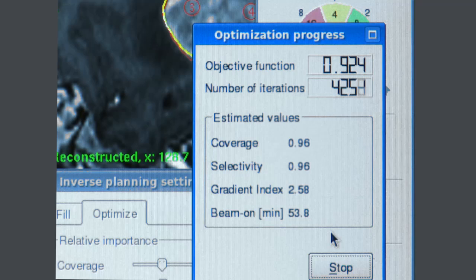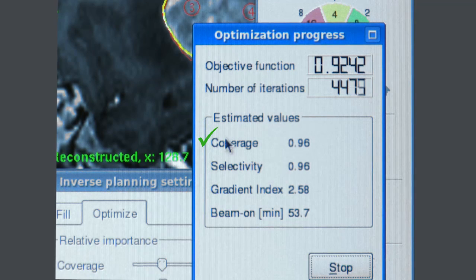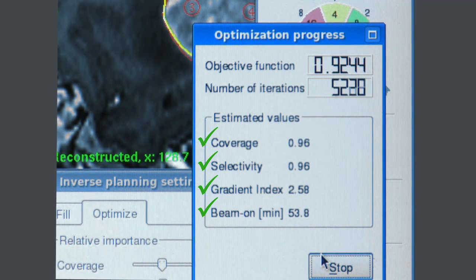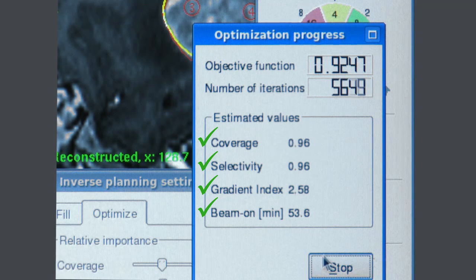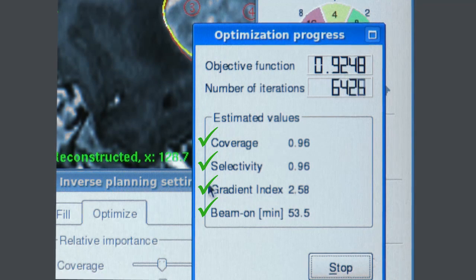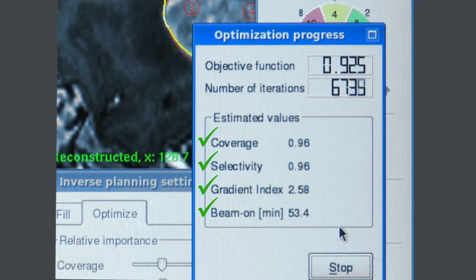Gammaplan gives you real-time feedback of your coverage, selectivity, gradient index, and beam-on time while the Inverse Planning system is improving the plan. This is extremely useful because you can see your overall conformity of the treatment plan, the gradient outside the target, and how long the treatment is going to take while the optimisation is taking place.